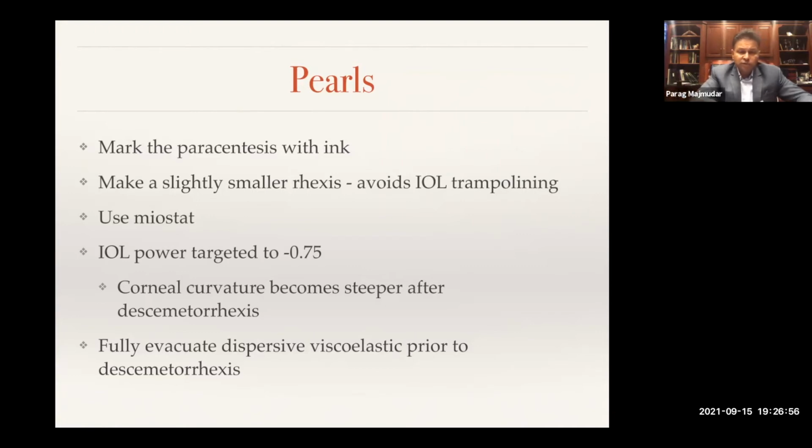And if you've already used phenylephrine before, you've kind of already saturated most of those receptors. Adding more phenylephrine is not going to give you as much of an effect. So a lot of times we'll see that when I just use tropicamide and then I use intraocular epinephrine, I'm going to get a real nice pupil, but it also responds well to Miostat or Miochol when I'm ready to do my DMEK. So we'll talk about that.